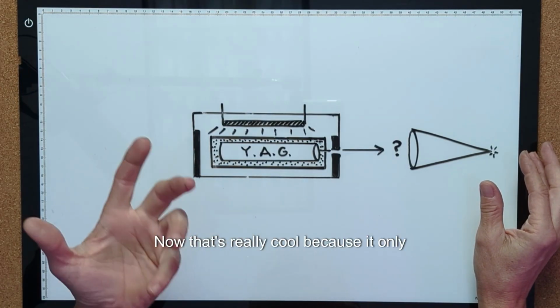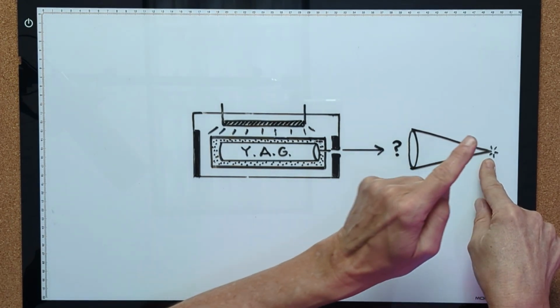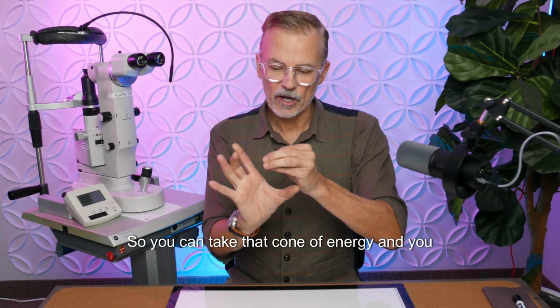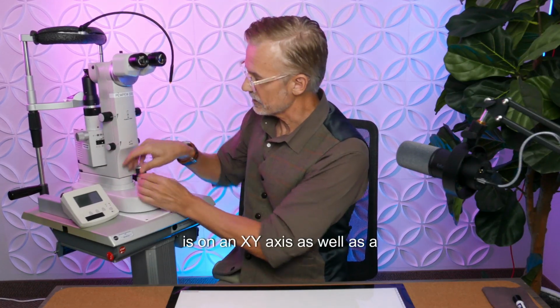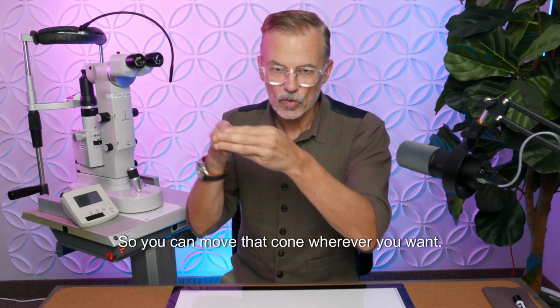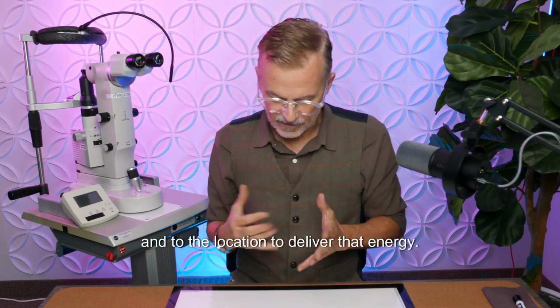Now that's really cool because it only delivers energy at the apex of the tip of that cone, which is right there. So you can take that cone of energy and very precisely move that wherever you want, which is why this laser is on an XY axis as well as a Z axis up and down. So you can move that cone wherever you want into the location to deliver that energy.